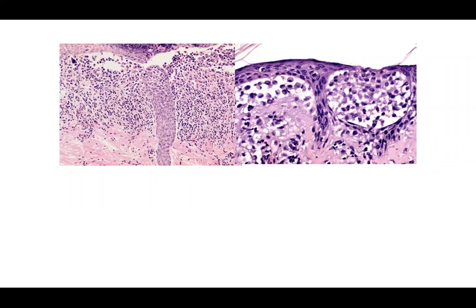But what if this is a young child with a seborrheic dermatitis-like rash unresponsive to ketoconazole, and the clinician wants to rule out Langerhans cell histiocytosis? You cannot rule it out here — you'd be very concerned because those microabscesses are filled with bean-shaped or kidney-shaped cells appearing clonal. You'd want to perform CD1a and S100 stains, which would most likely highlight these cells.